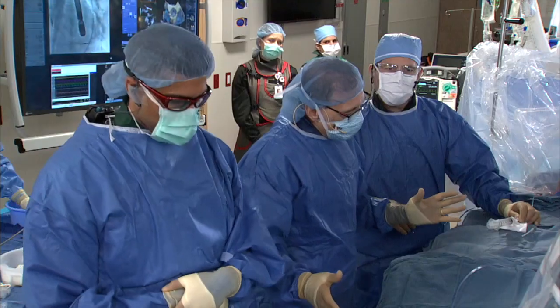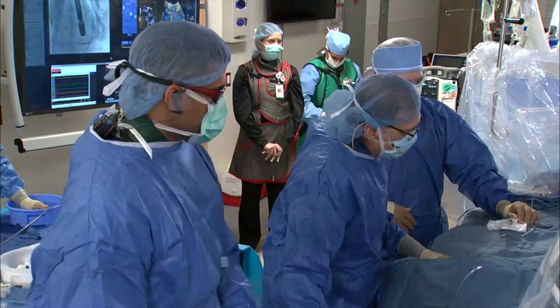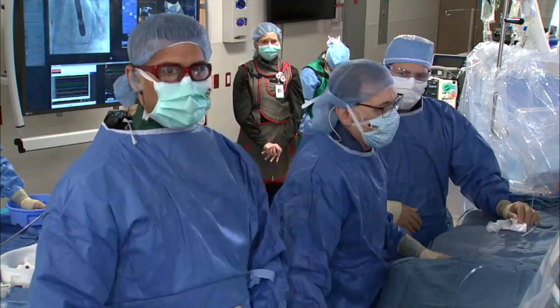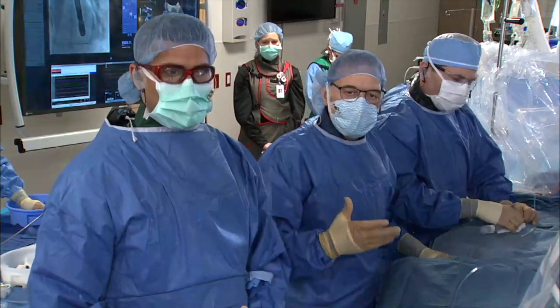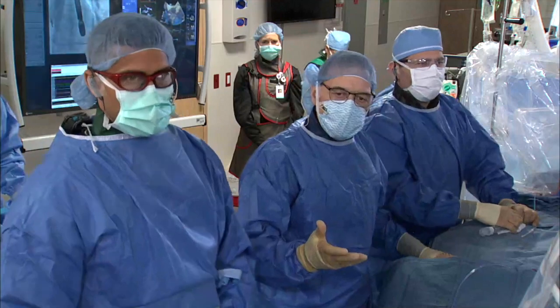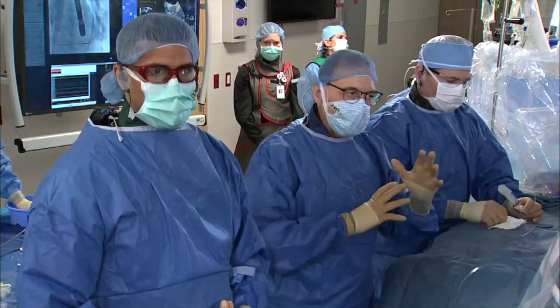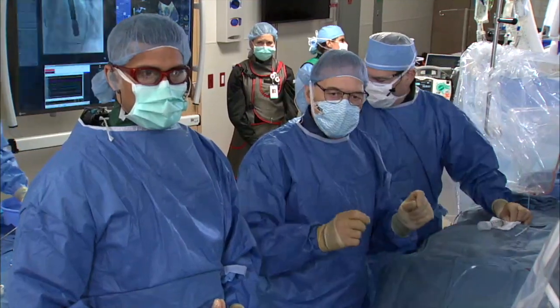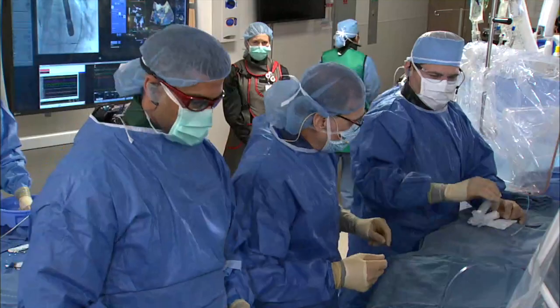So to the case, Bill, you talked about the retrievability and the ability to resheath, that you don't go through a hypotensive phase, and that the paravalvular leak data with this looks great. You and I have chatted recently about when you find infraannular calcium, the potential benefits of this device. Why don't we start working, and maybe you and the panel take us through your thoughts on that.